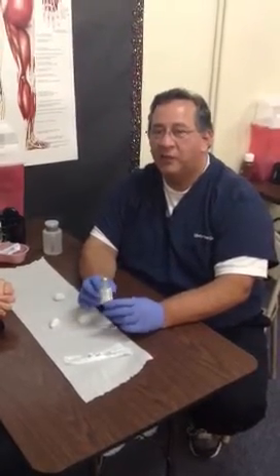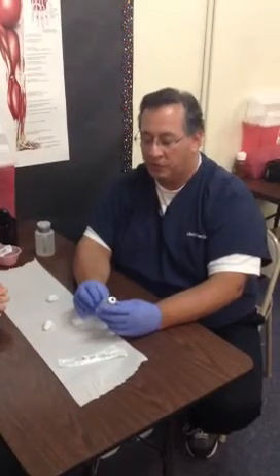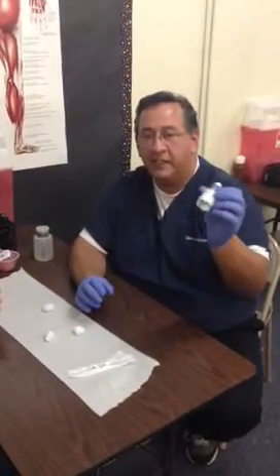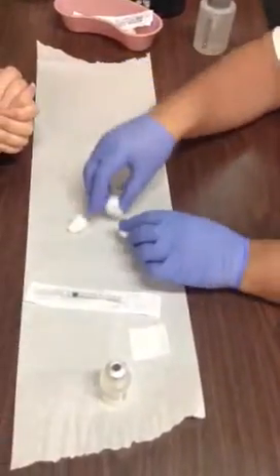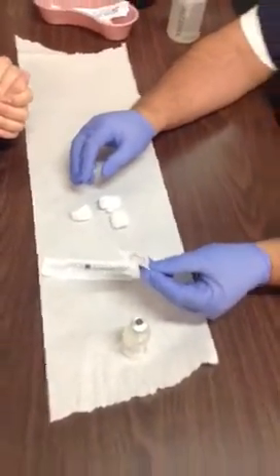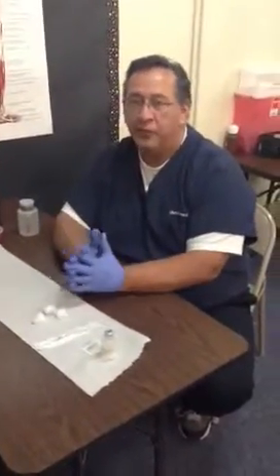Hello, in this video we're going to show you how to perform a subcutaneous injection, also known as a sub-Q. To get started you're going to need to do a lot of the same things we did for the intradermal. You want to make sure that you've washed your hands before the procedure, that you've set your table up. For the sub-Q you're going to need some sodium chloride, a 27 gauge half inch needle, a couple of cotton balls, and of course a spot band-aid. Make sure all your supplies are assembled, you've washed your hands, and that you've put on your gloves.